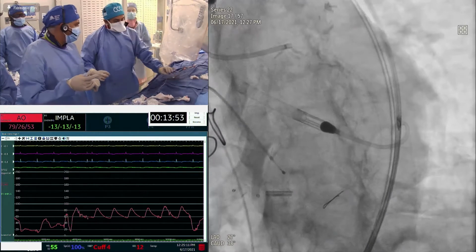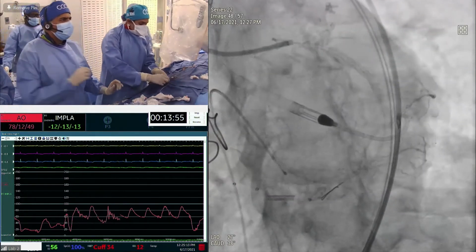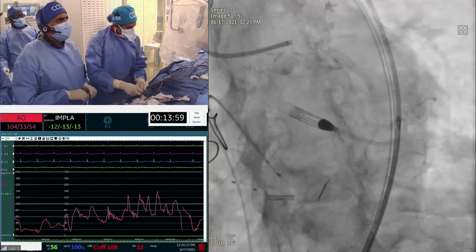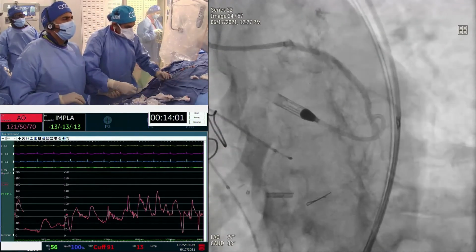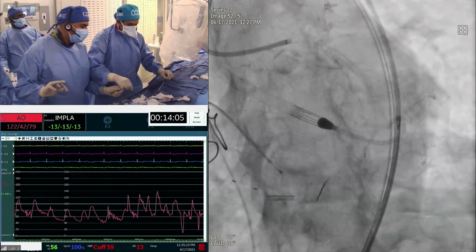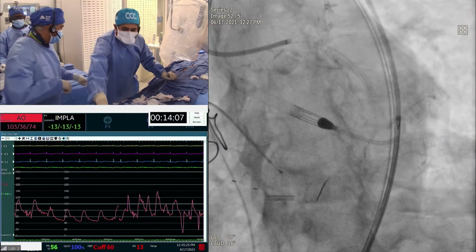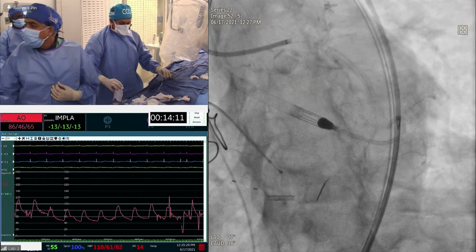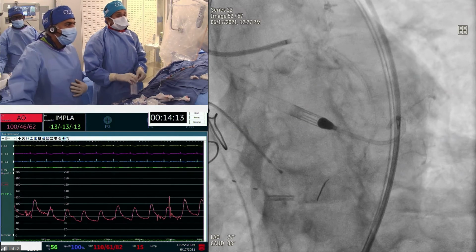I mean, it's tremendous. But there is a step down. This is a step down. We are very reluctant to place these long stents. They restenose. If you look at these long stents after 3 or 4 years, they always restenose. Dr. Mehta? Yeah, Roxana, I think a 3.5 by 12, distal to the stent, will be all right.